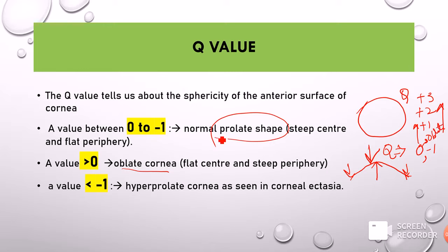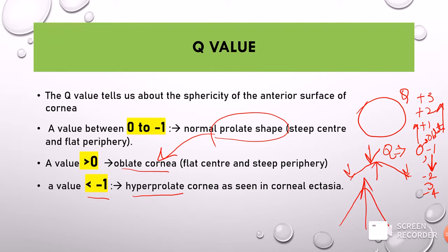From prolate, the cornea changes to an oblate cornea. This occurs usually after refractive surgery like LASIK, in which we make the prolate cornea into an oblate, flatter cornea. Sometimes Q values can be less than minus 1, going to minus 2, minus 3, minus 4 — meaning the cornea is hyperprolate, where the steepness increases. This is seen in corneal ectasia. So anything above 0 or below minus 1 is abnormal, and specifically below minus 1 indicates corneal ectasia.